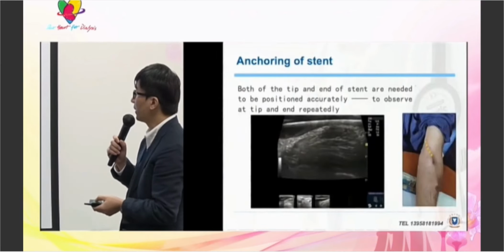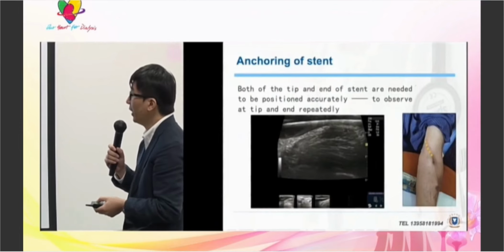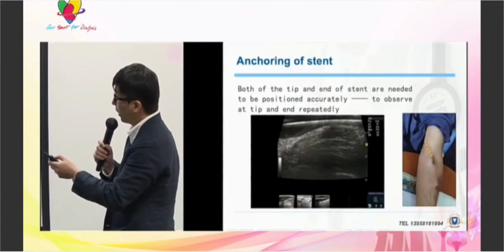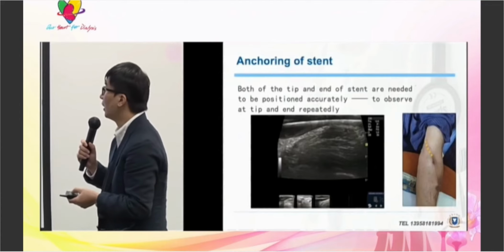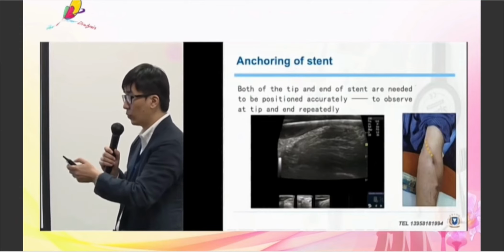Both the tip and the end of the stent need to be positioned accurately. It's difficult. Why? We should observe the tip and end of the stent repeatedly to check the position.